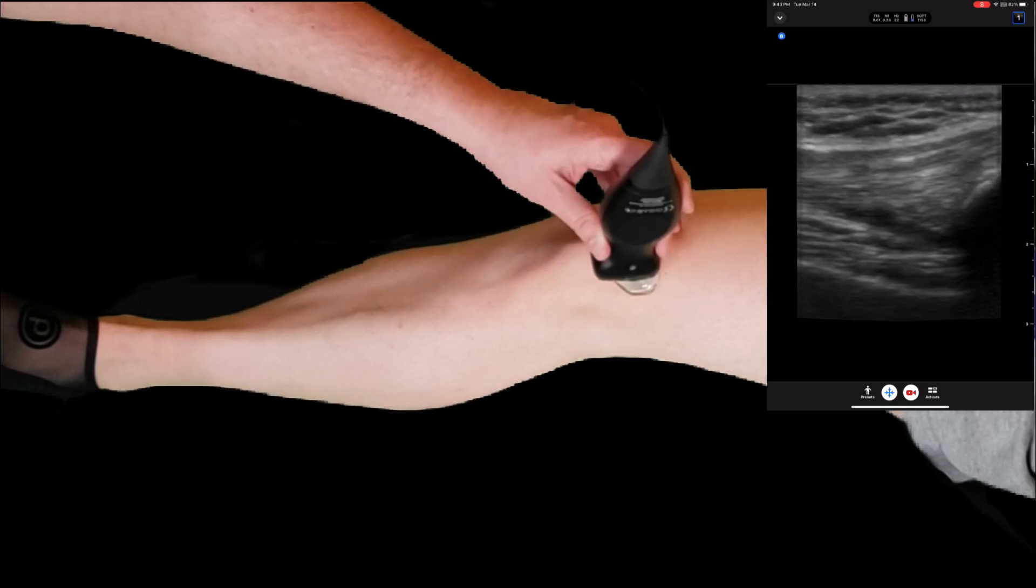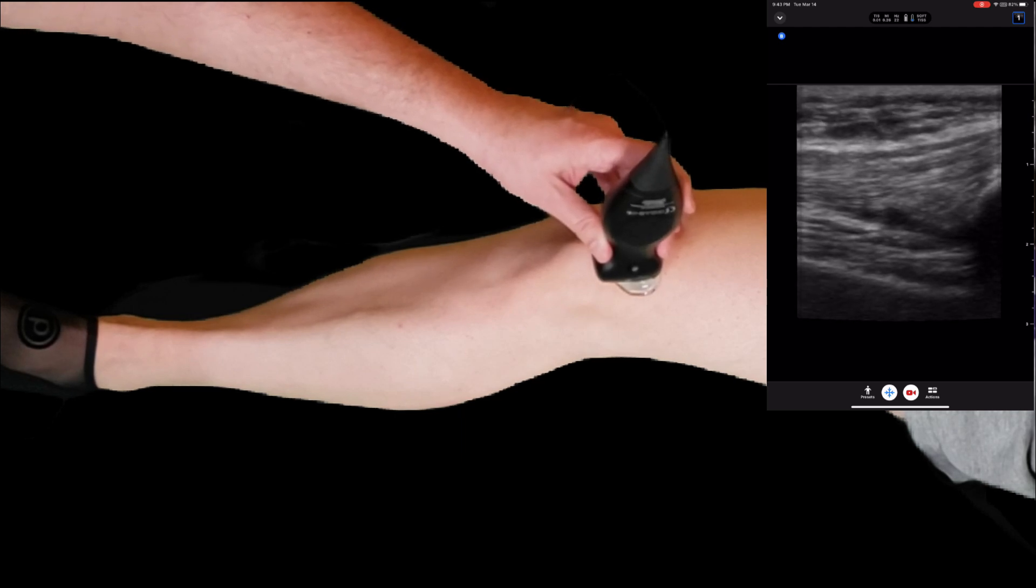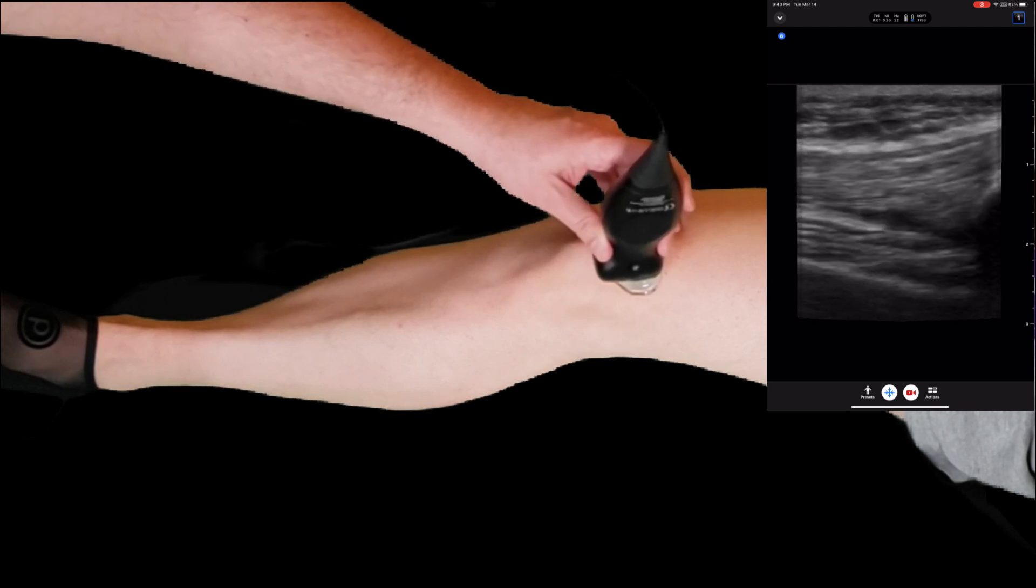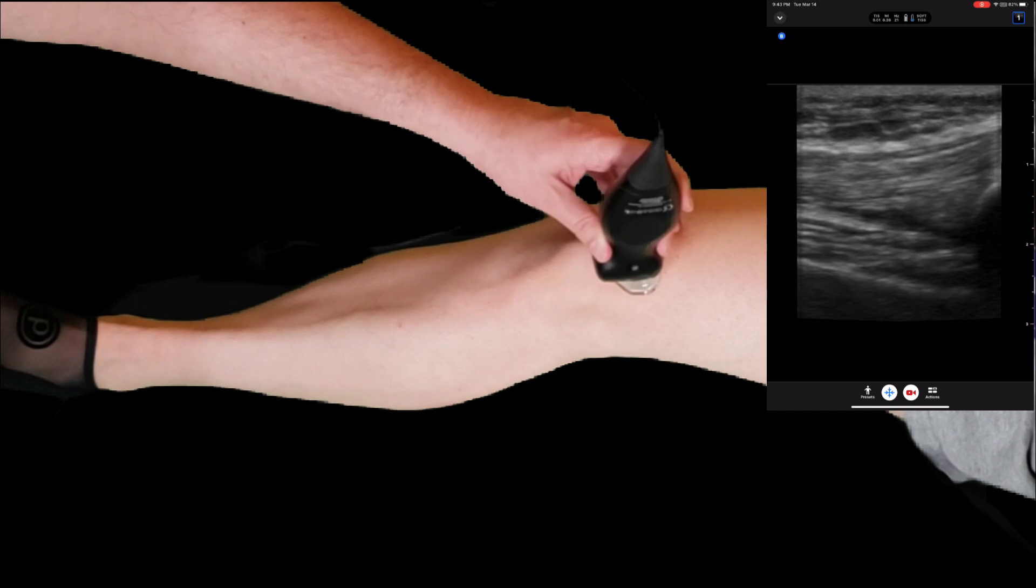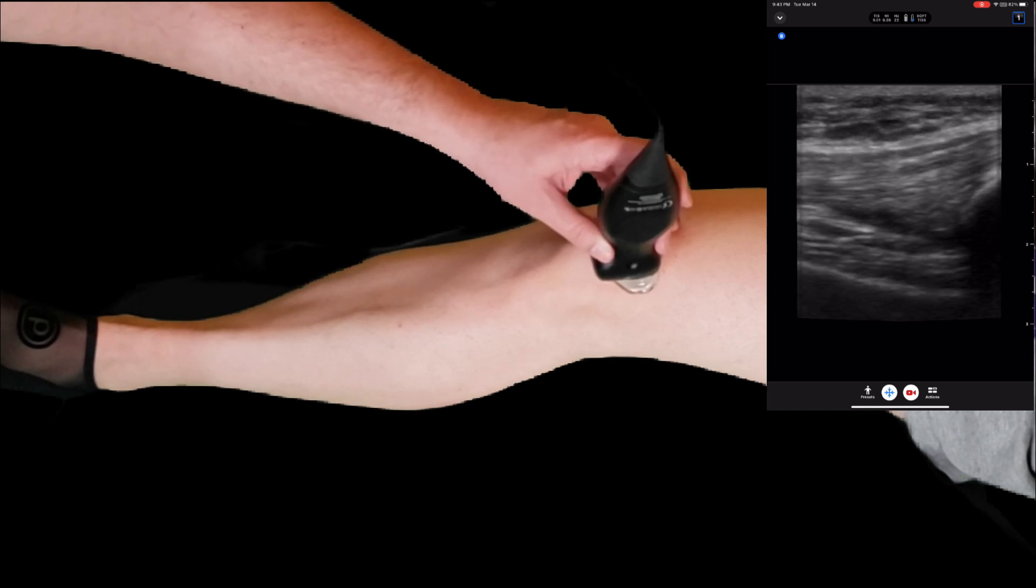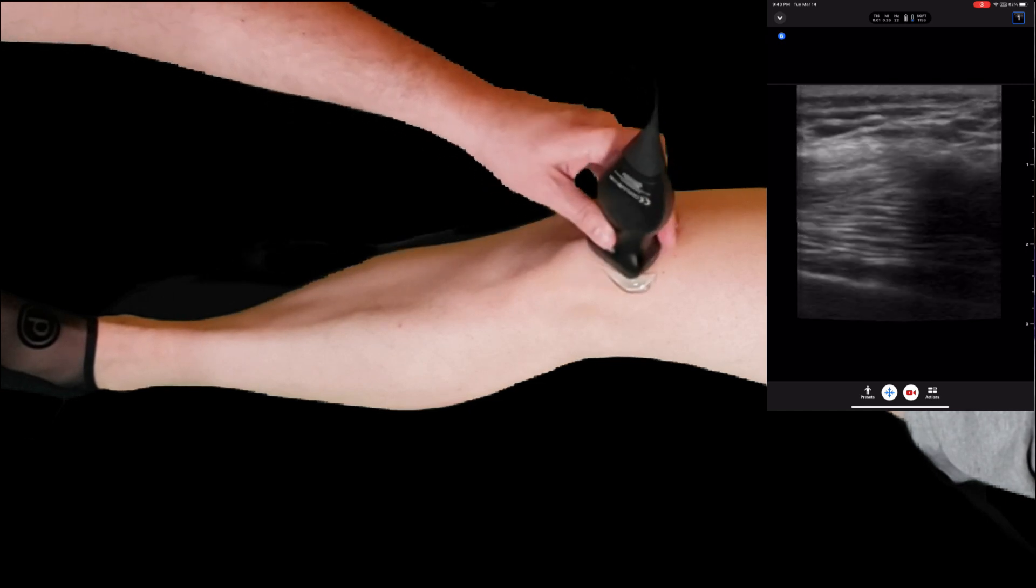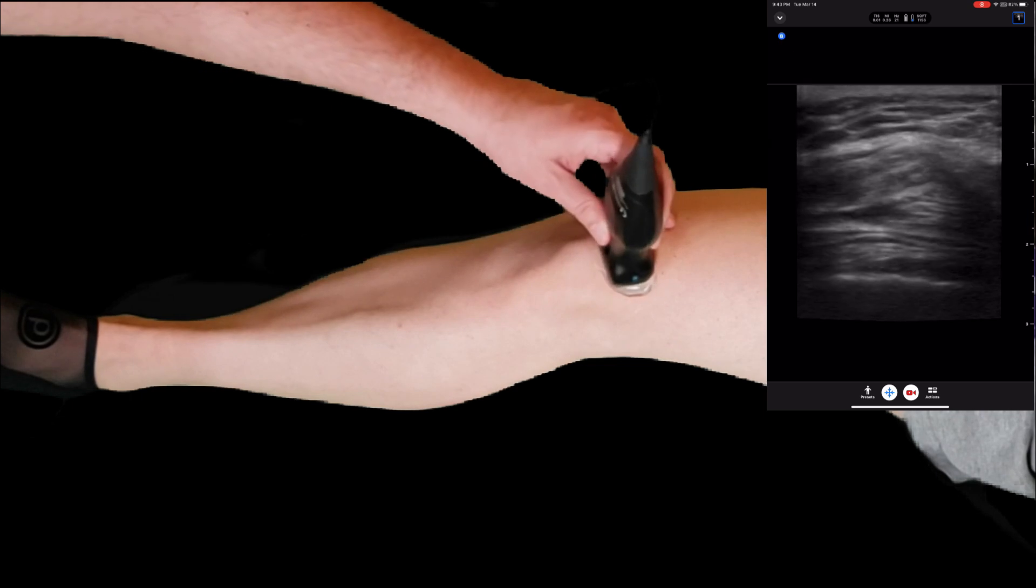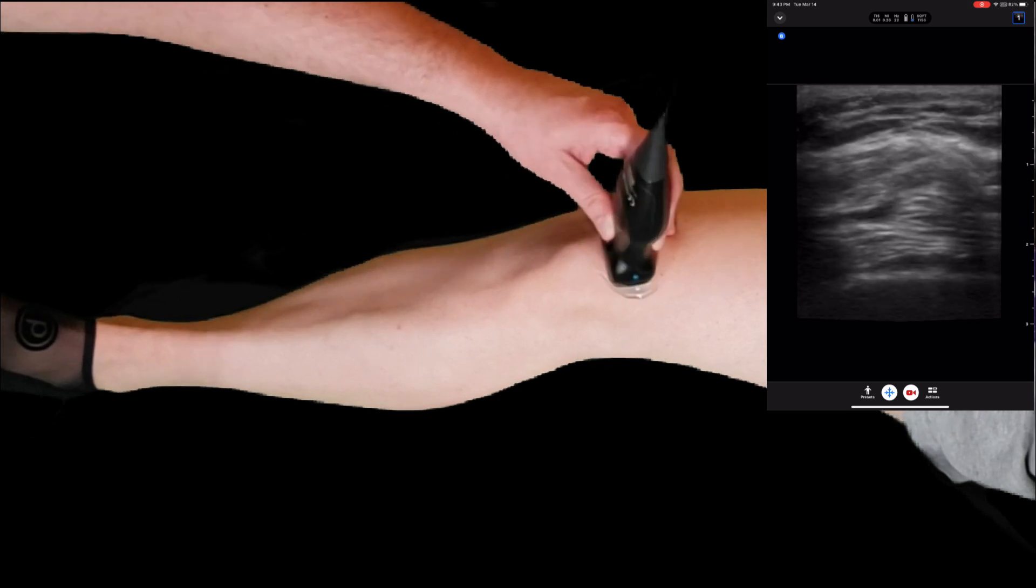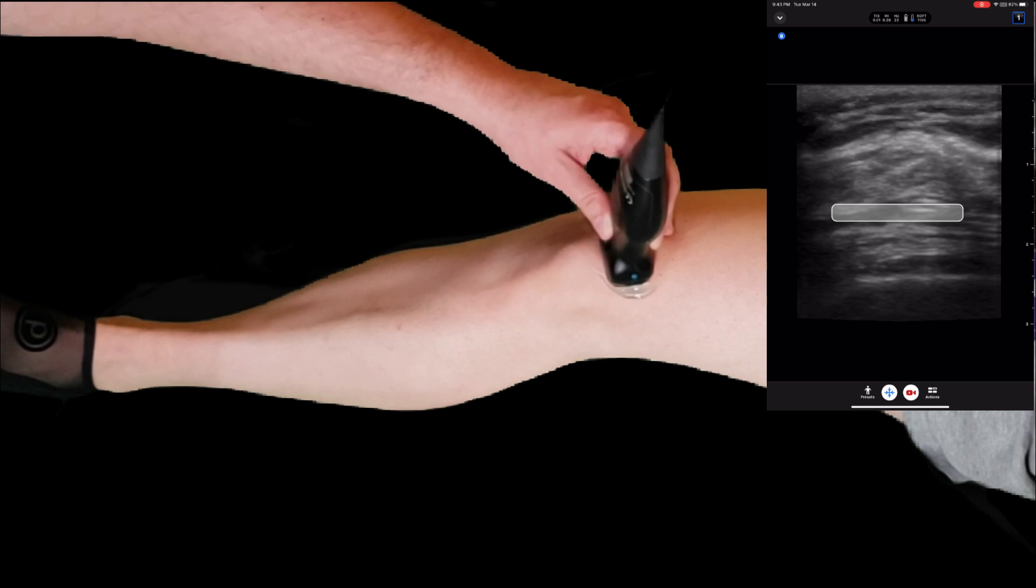If you're doing a knee joint aspiration, you would find the largest fluid pocket, rotate your probe 90 degrees, and guide the needle to the suprapatellar pouch to aspirate the fluid.